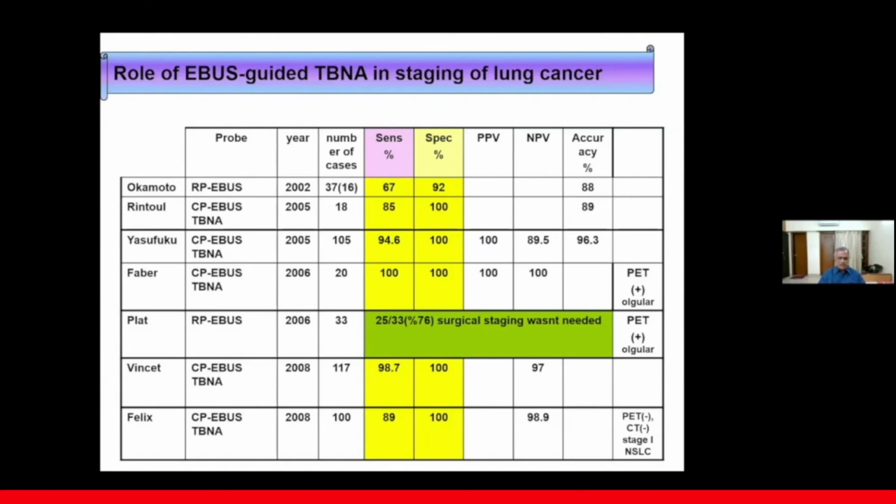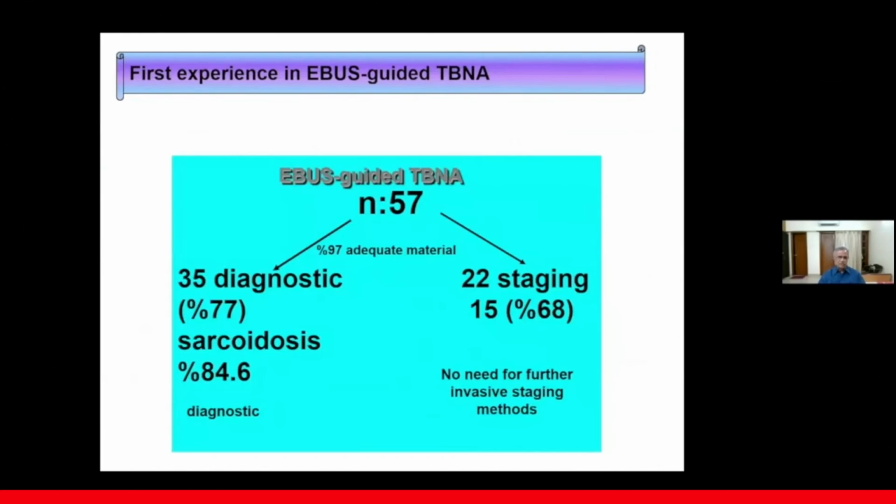My pathologist tells me that if it is malignancy, diagnosis is the least of the issues. Many times there is blood, and there is always a possibility that you might get a negative report. But in malignancy, no such problem arises.